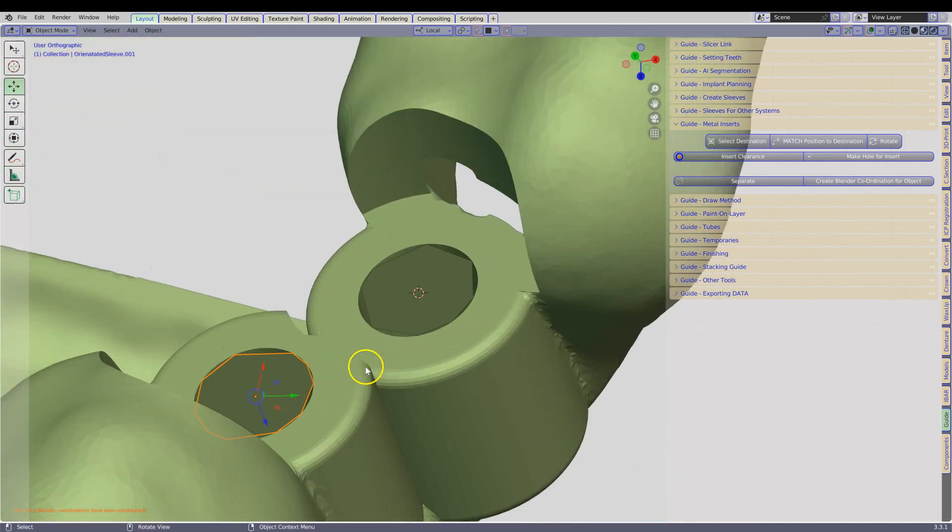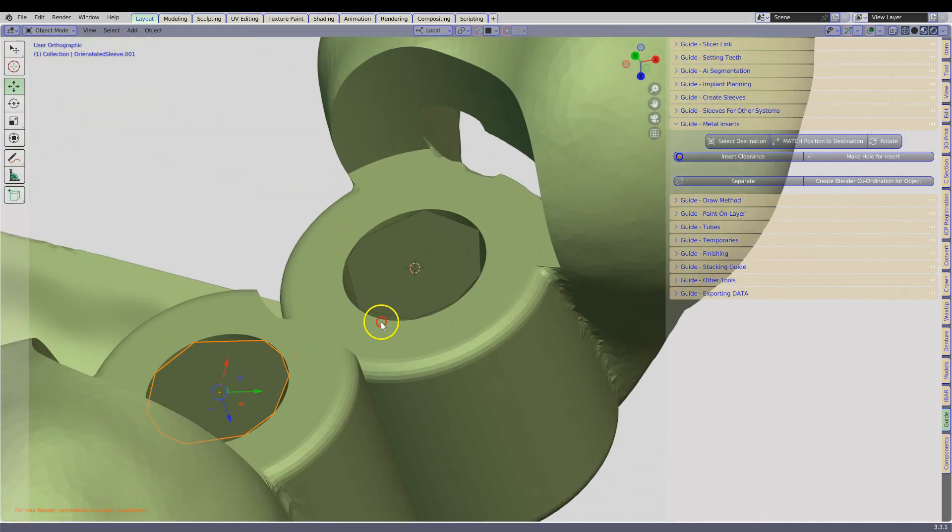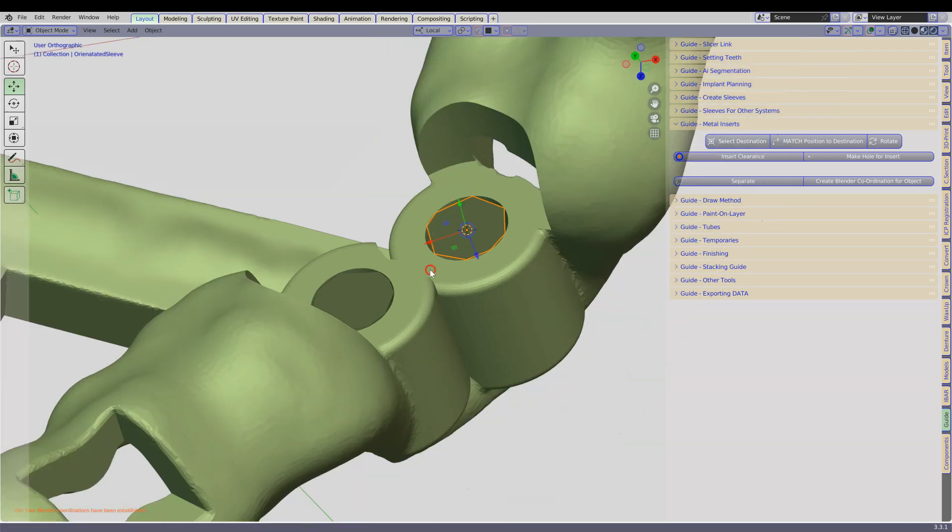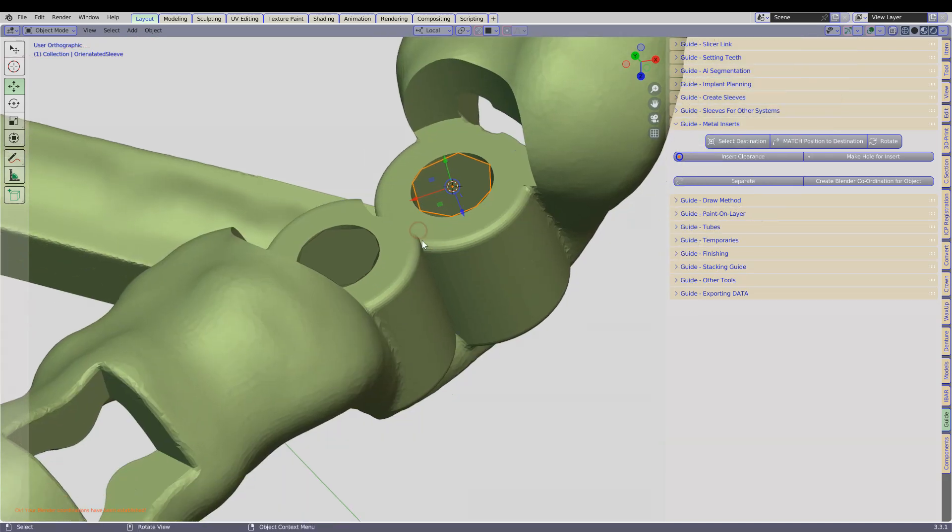Alright, so we have got this object and we have got this object. We are now able to insert our guide cutters.